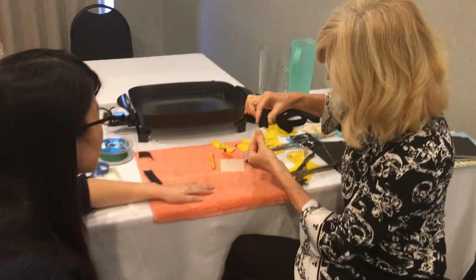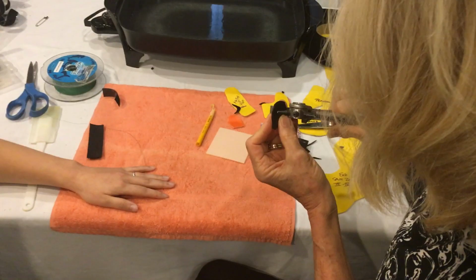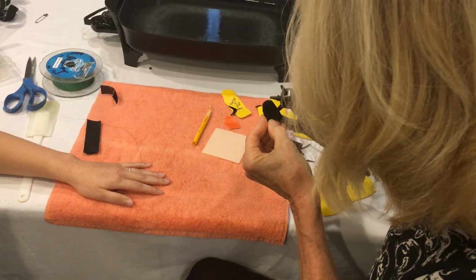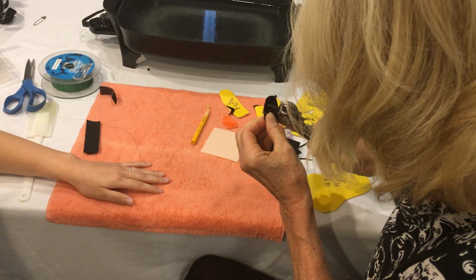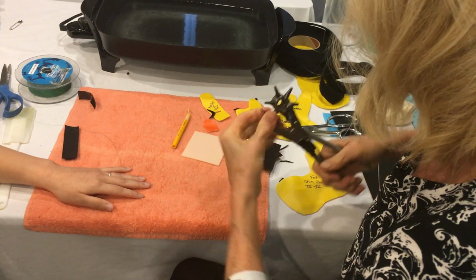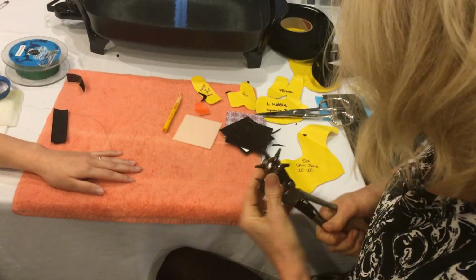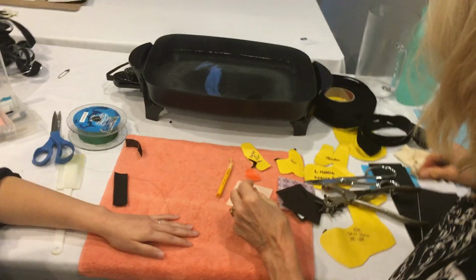The pattern sort of looks like this. Then I'm going to punch 2 holes into the splint material, leaving enough surface on the edges to support the middle phalanx and the distal phalanx. They may be too close together. Yeah, it's pretty close together. We'll see what happens.